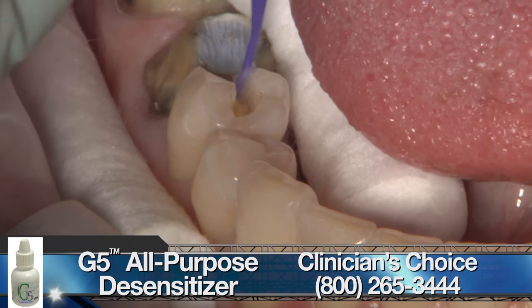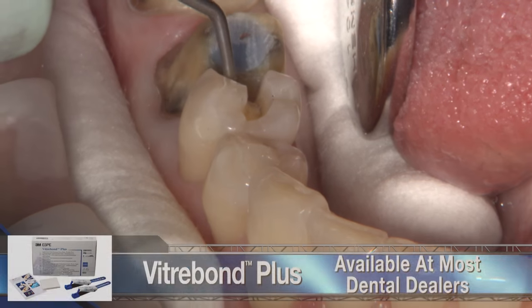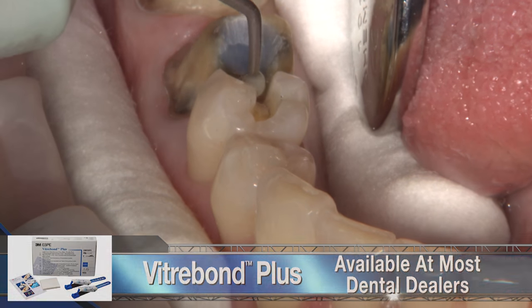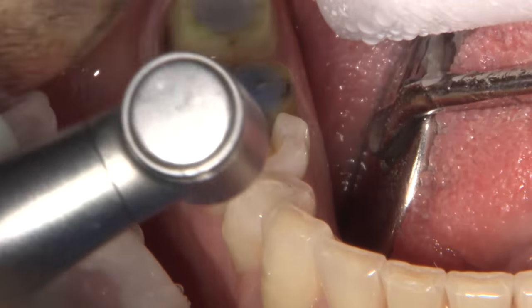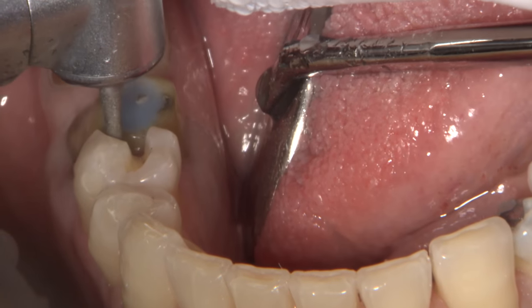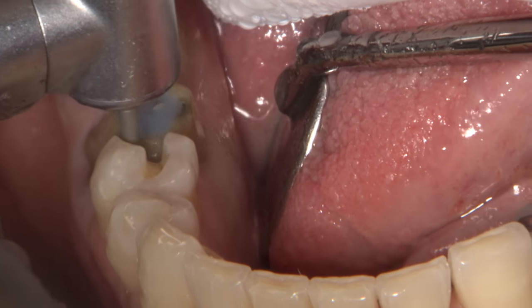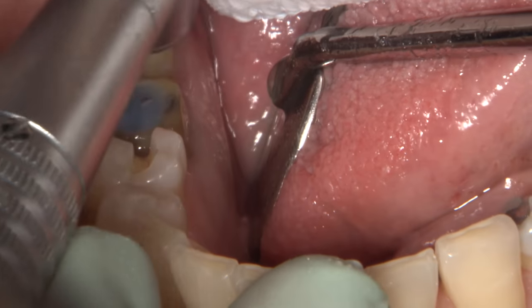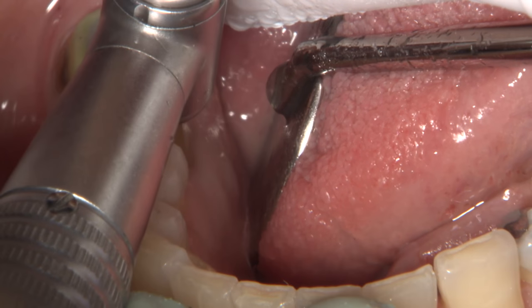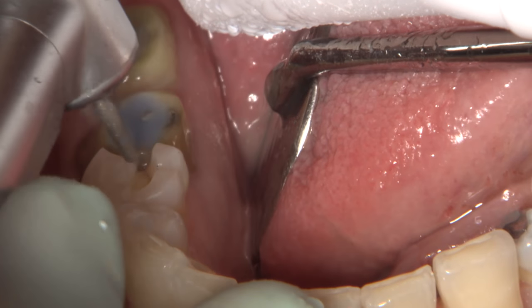G5 was added to dentin to desensitize and remove contaminants, and Vitrebond glass ionomer was added to the distal axial wall of number 29 and polymerized. An important step that I like to do before final impression is sealing the freshly cut dentin on number 29. For that, just before the application of the dentin adhesive, I use a diamond burr at a slow RPM with water spray. This is not to re-prep the tooth, it is just to refresh the surface, to flush any debris away and refresh the dentin smear layer and have a totally clean surface.